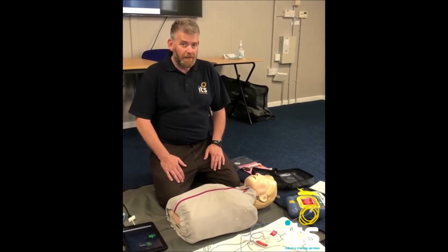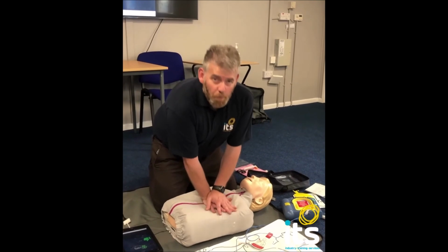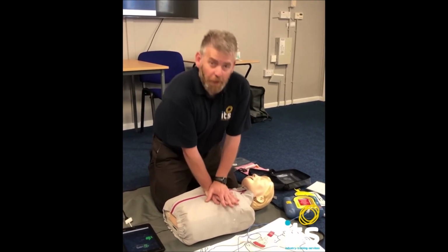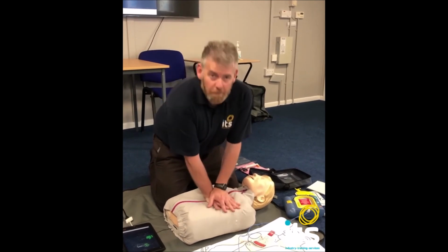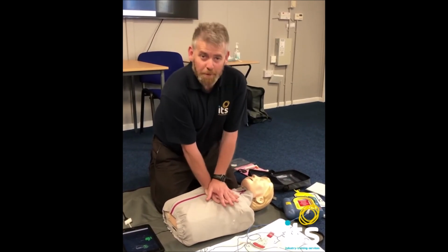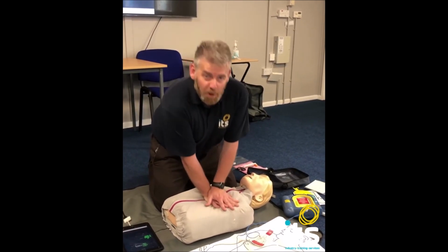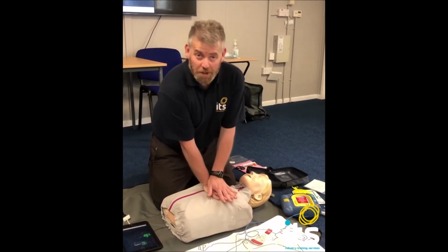Continue with compressions. We're now into the 5th round of compressions. Once I've done 30 compressions in this round, the machine will tell me to stop, and it will reanalyse the patient. This can take 15 to 20 seconds, and depending on what the machine finds will depend on what it says.